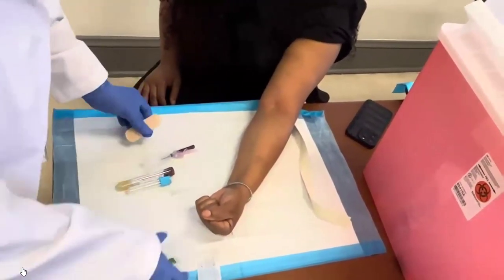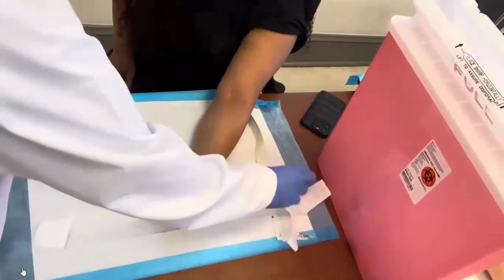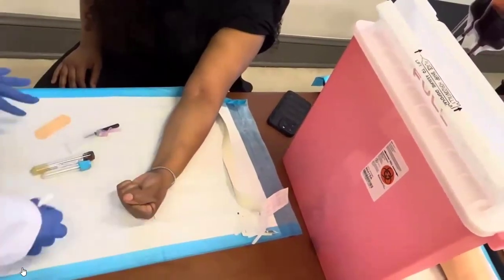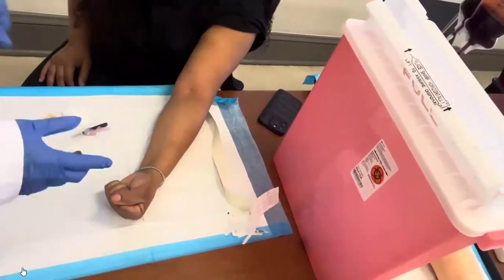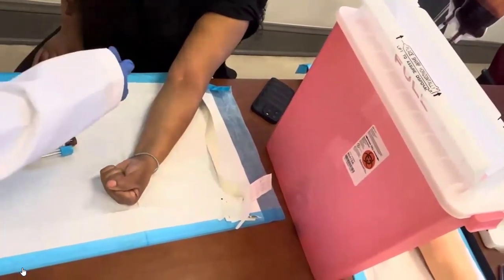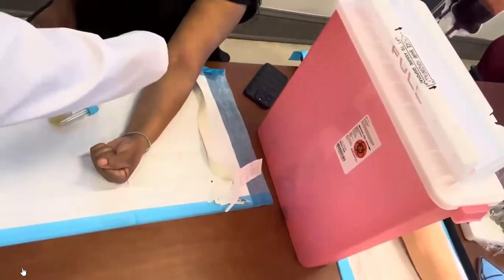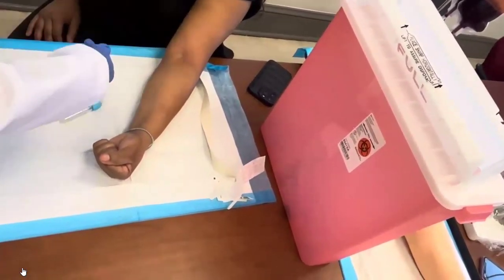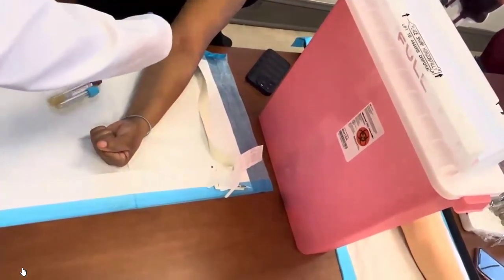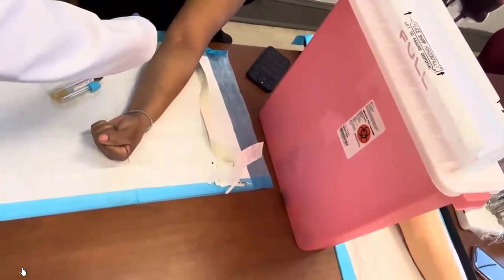All right, so I'm going to put that there. Now my dirty stuff, I'm just going to kind of put that to the side because I don't want it all to get mixed in, right? Just going to put that over there. Okay. All right, I got my gauze here. Now, this is very important. When you are doing phlebotomy, you're going to have a needle inside your patient's arm. You don't want to be moving that needle all over the place. So whatever hand you're going to be sticking with, just remember your supplies are going to be next to the opposite hand, okay? Because once you stick that patient, your hand can never move. The only hand that should be moving is your opposite hand, okay?